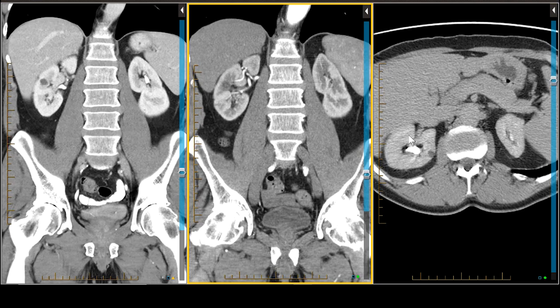Is it easier on MRI to rule in or rule out enhancement? We have other tools we can use, which we'll cover in the next vignette. One important caveat: with new multi-detector CT scanners, there is increased Compton scatter, which leads to a lot of pseudo-enhancement. So we need criteria for what actually constitutes true enhancement. Enhancement is defined as greater than 15 Hounsfield units between the pre- and post-contrast images.